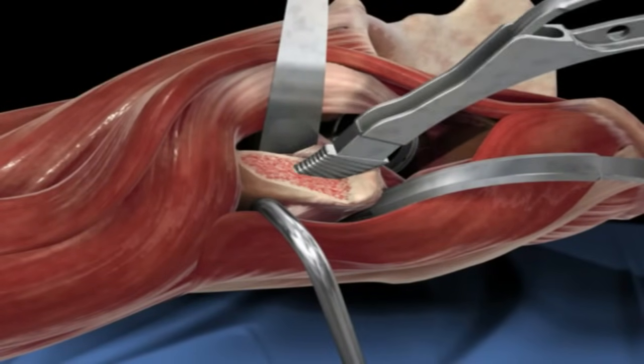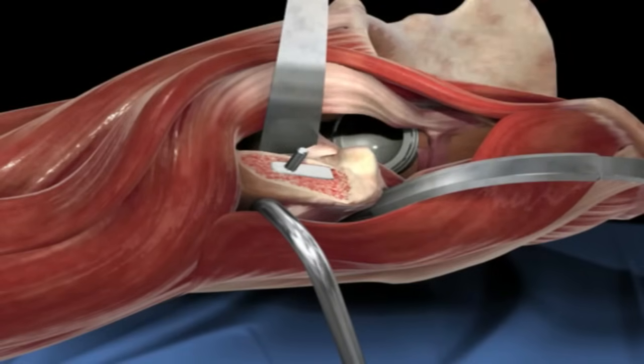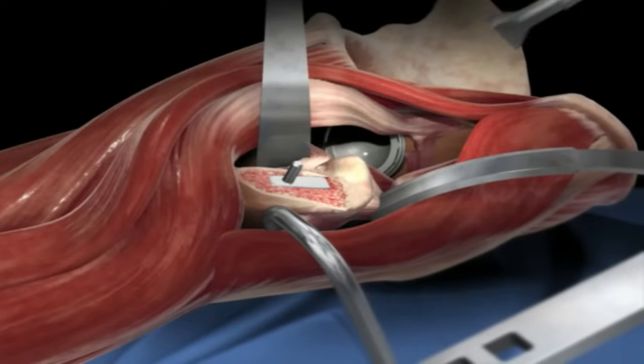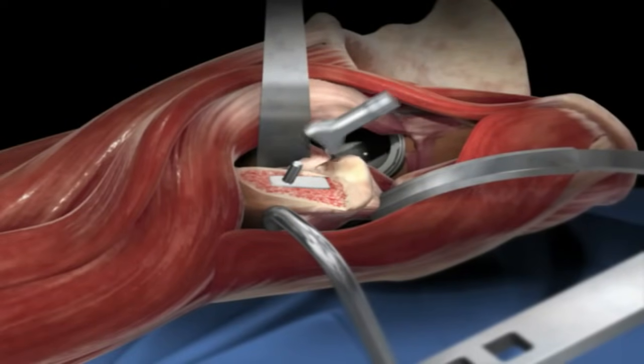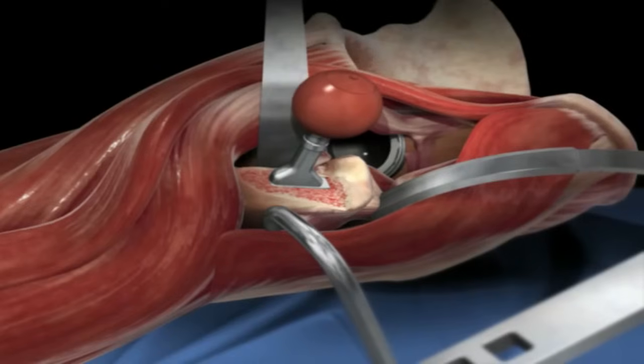A surgical tool called a broach is inserted into the canal of the femur. The surgeon begins with a very small size and gradually works up to a size that fits nice and tightly into the canal. Once you get to the appropriate size, the stem is placed and then a trial plastic femoral head is inserted.